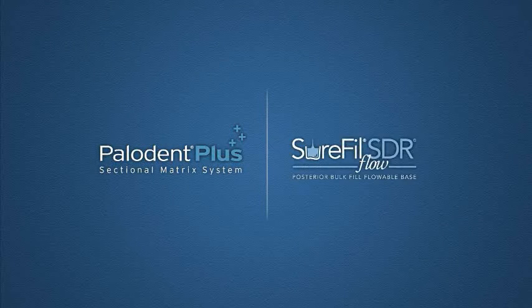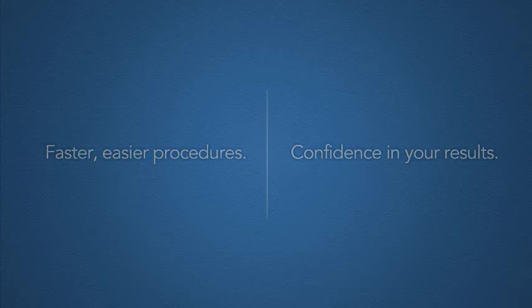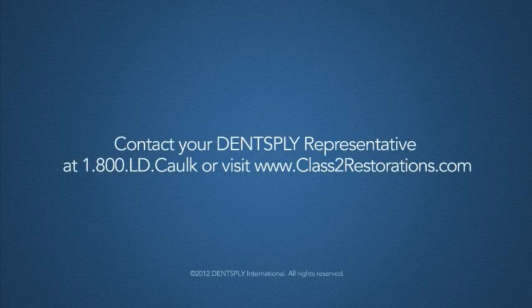Paladent Plus and Surefil SDR Flow give you total control over Class II restorations, for faster and easier procedures and confidence in your results. Contact your Dentsply Caulk dealer, or visit our website for more information and ordering details.